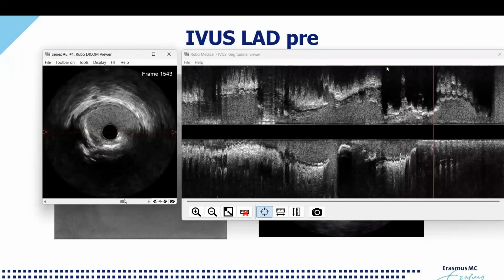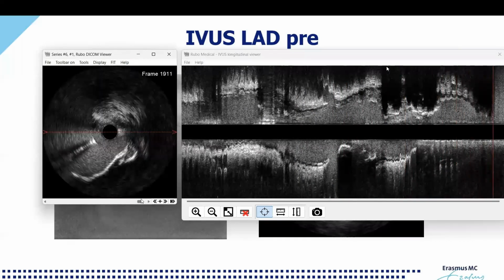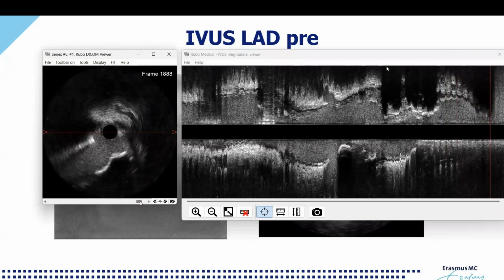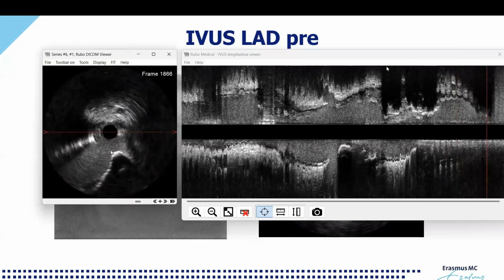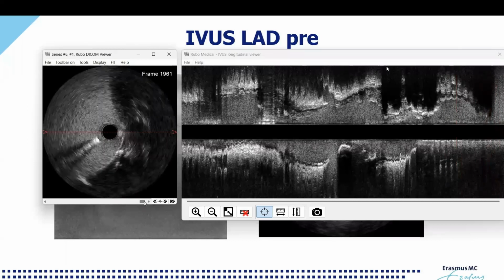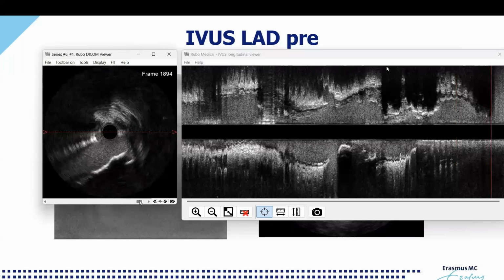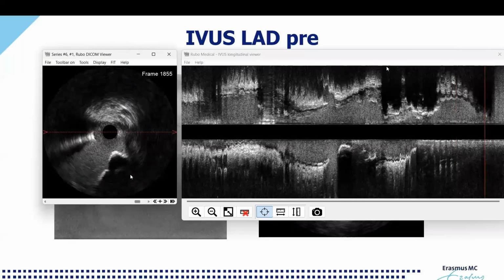But what's also there is that we have a nodule in the left main stem here. Here with the left main, we have the circumflex. I expected the left main a little bit longer visible, but often in the left main your IVUS catheter is a bit tilted, it looks to different sizes. But we see a calcified nodule in the left main there.